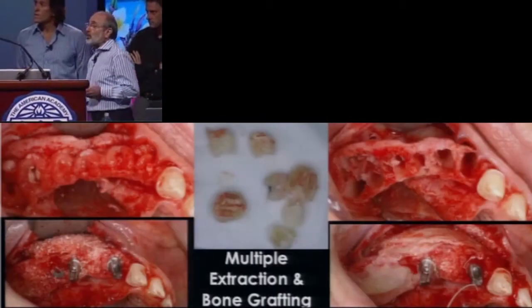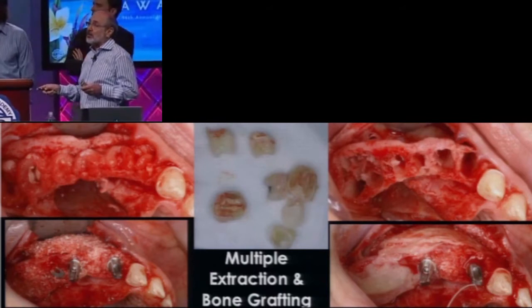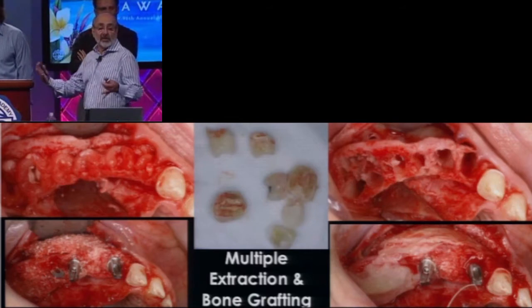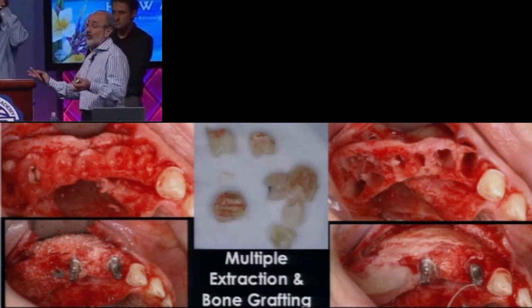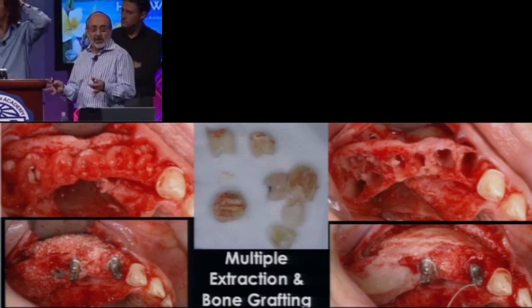And as we're going through this process, really key is to maintain this buccal aspect, as well as obviously the interproximal. This is really considerably more difficult. Utilizing over here the piezo surgery, which really took a bulk of the time in this. And then a decision making, and we're talking about decision making.